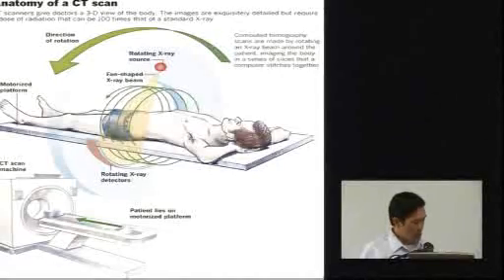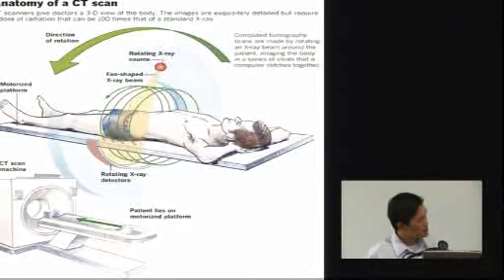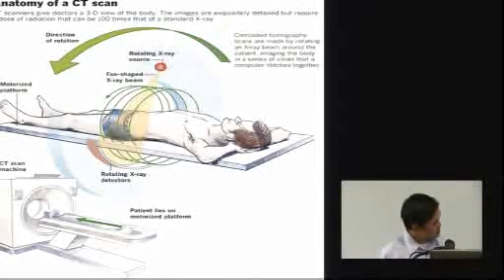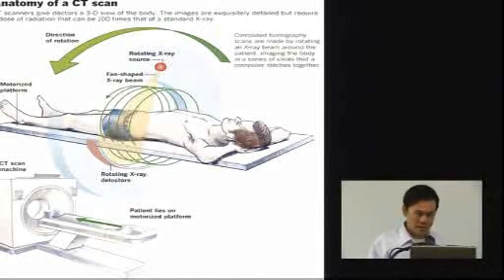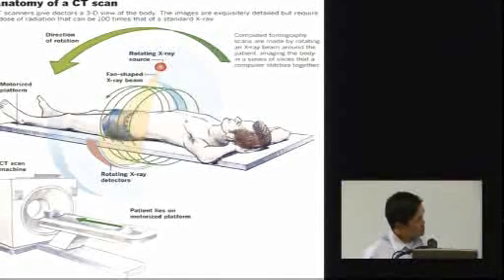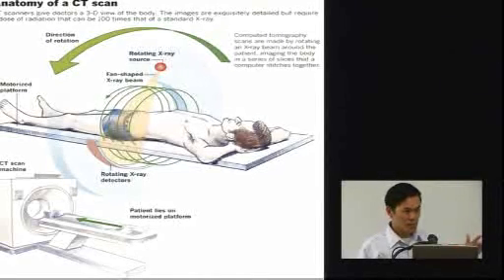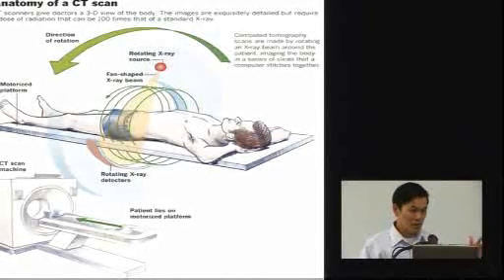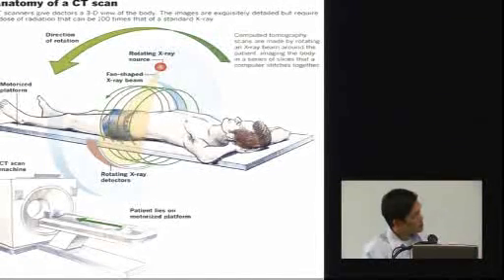All right, so I know this is probably a very sophisticated audience, but I thought it would be useful to find out what some of these scans are. So first of all, a CT scan. A CT scan is like a standard X-ray, except this X-ray is mounted on a machine that rotates around your body. It takes not just one X-ray, but multiple X-rays. In fact, it takes multiple hundreds of X-rays, if not thousands, as it rotates around your body.